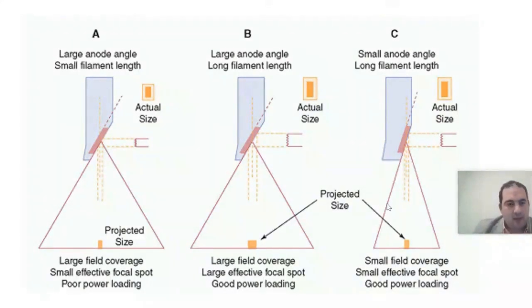This device, for instance, if you are doing a limb scan and performing lower limb angiography, it might not last the full 150 centimeters. If there is a long scan, you might find the device stopping because its heat capacity is low. So, I need a device with 5 megaheat units, or if it's a 64-slice device, I need 8 megaheat units. This way, my tube loading or power loading will be good enough to handle the high parameters.